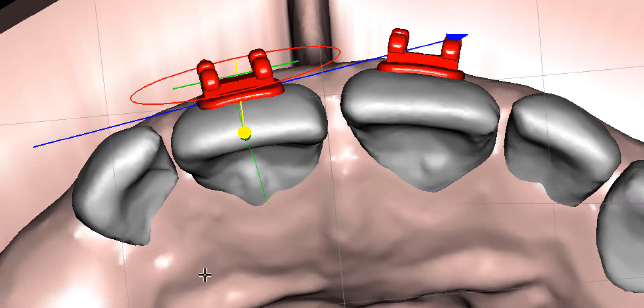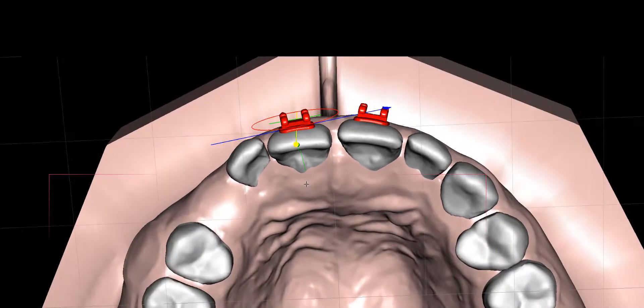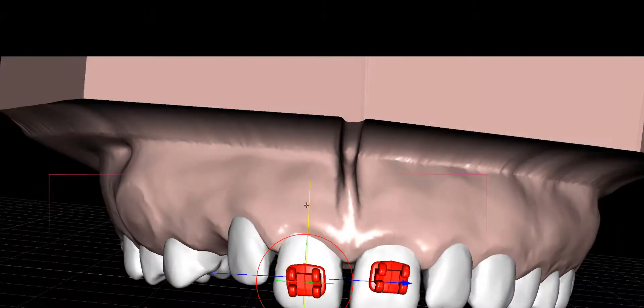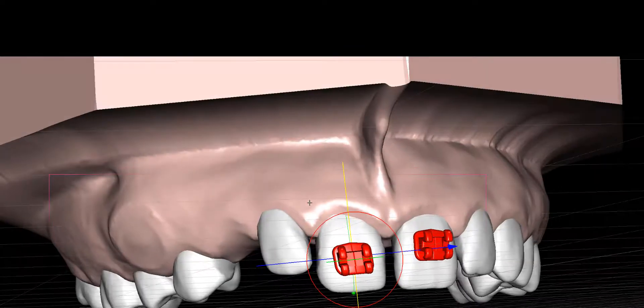Please have a look from the occlusal aspect of the tooth and also from the labial aspect.